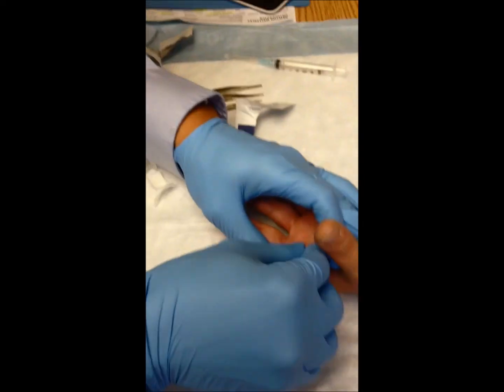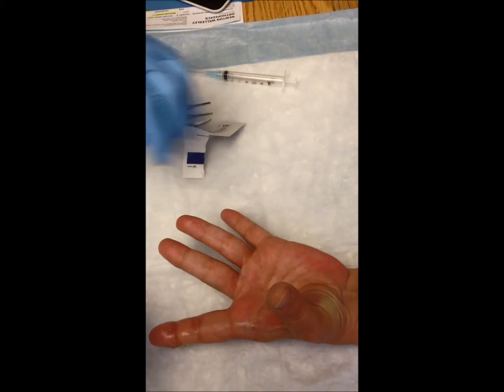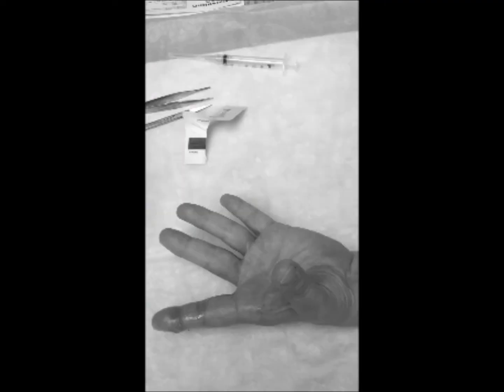To complete the anesthetic on the volar side of the finger as well as the fingertip, a separate injection is given on the volar side of the finger. The nerves are again outlined here, branching from the median nerve. The goal again is to raise a bubble of anesthesia at the base of the finger where these nerves are in close proximity.